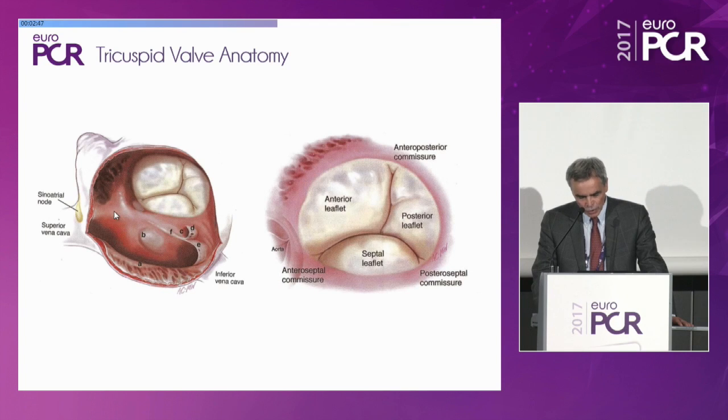And I think this is still a learning that we are entering into, to see where we can end at the septum with the Cardioband. And I personally believe, and we did a very nice case recently, that we can go as high as possible, much higher than probably has been done until now, so that we can cover the entire region, including major parts of the septum, so starting somewhere around here and then going all the way down and going around the septum until the mid-septal portion, where the septal leaflet is located.